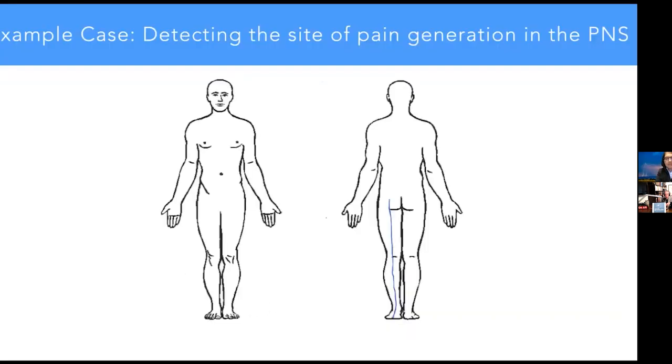Excellent. So one of the first tests we did was to take what we call a positive example of where we think someone is having pain, and ideally the tracer should localize to the pain generating source. This gentleman had already had an MRI which showed that he had a schwannoma in his lower extremity and was likely the source of his lower extremity pain, which is where he marked on his diagram where he was hurting, by this blue line down his left leg.